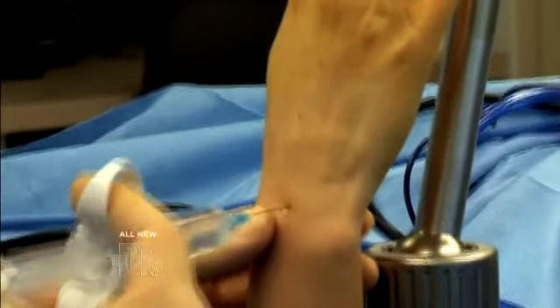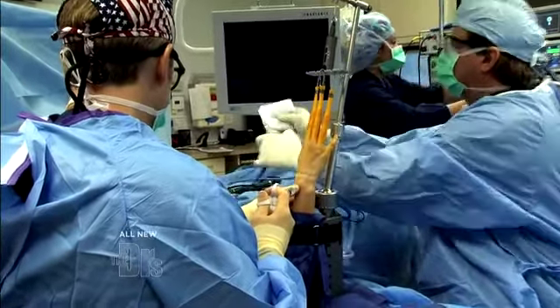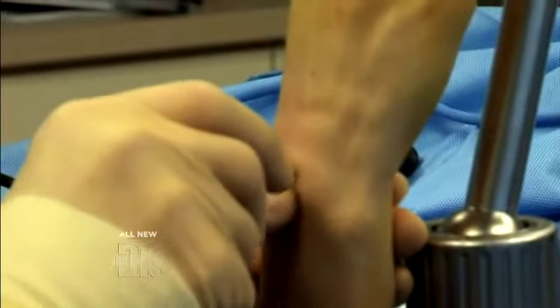I'm going to inject some fluid in there that will distend the joint and allow the scope to go in easier, and we'll make our first of two cuts. This is the cannula that the arthroscope, or lighted tube, will go through.